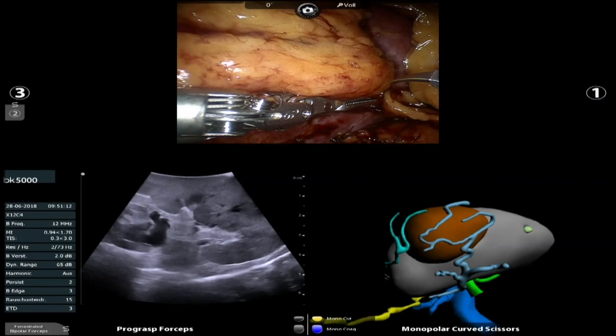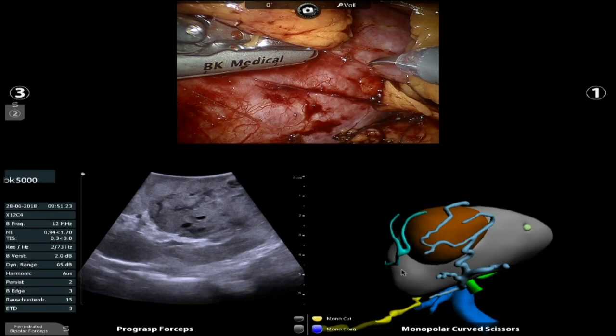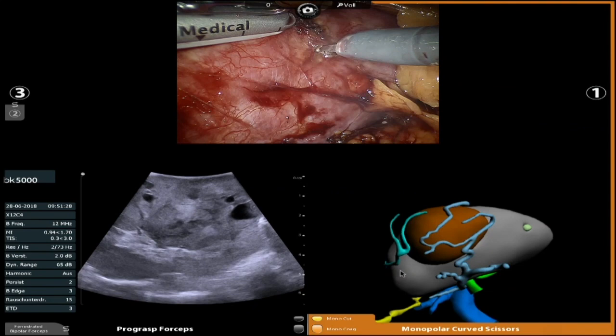All right, so there's normal kidney. What I'm going to do is I'm pulling the ultrasound back until it reaches the left side of the screen. So right here. So that's the tumor edge right there. So I'm going to make a little mark right here. Same thing here. I'm going to pull back the tumor.